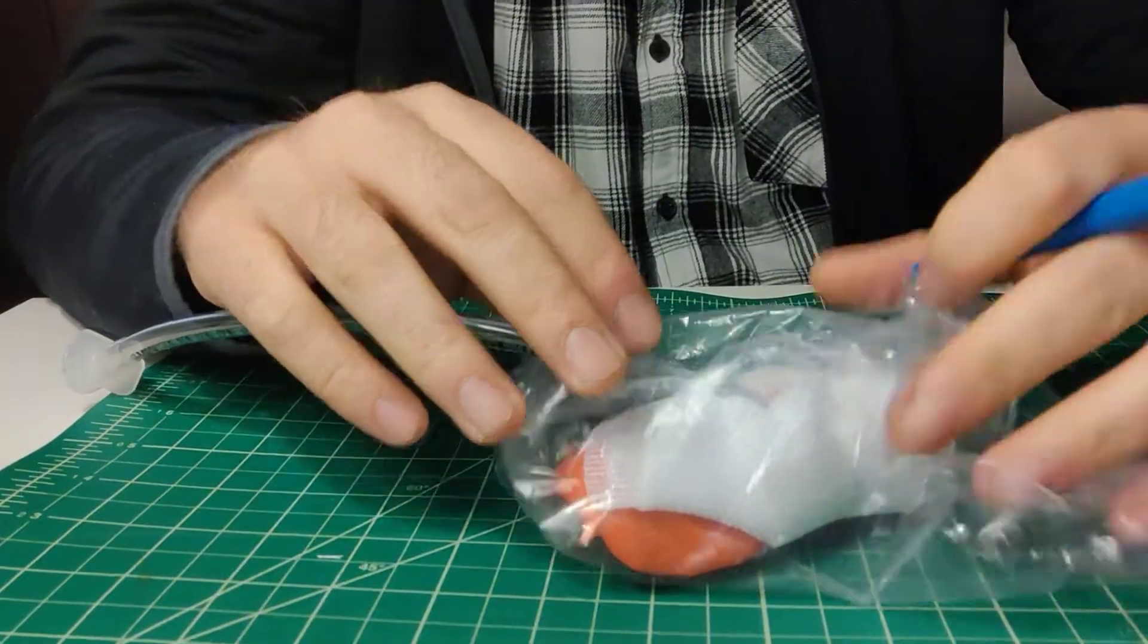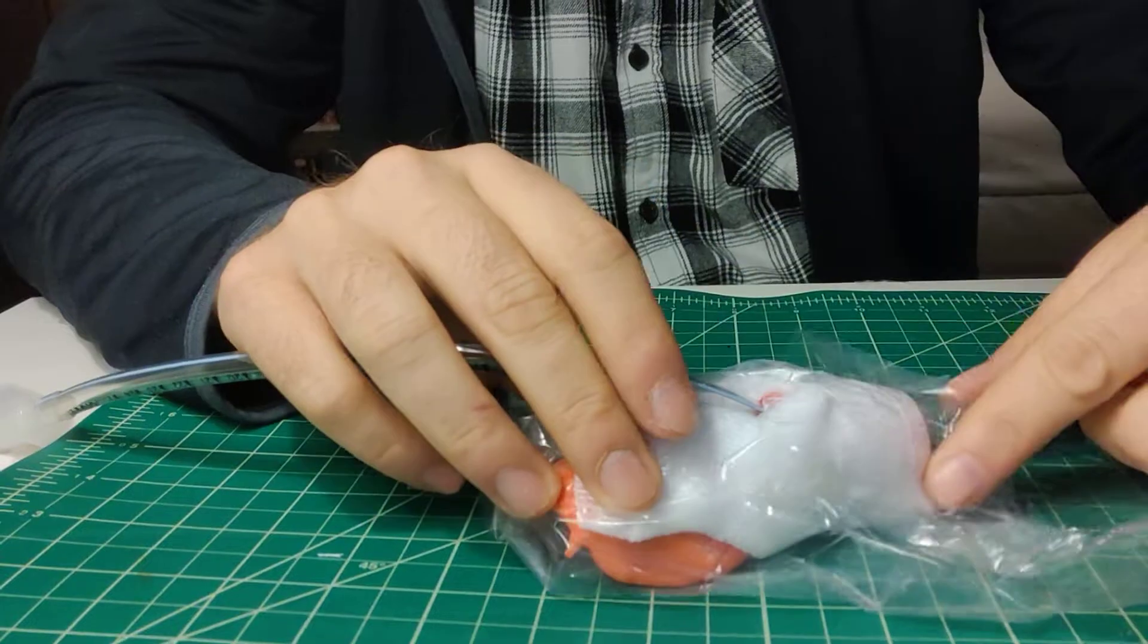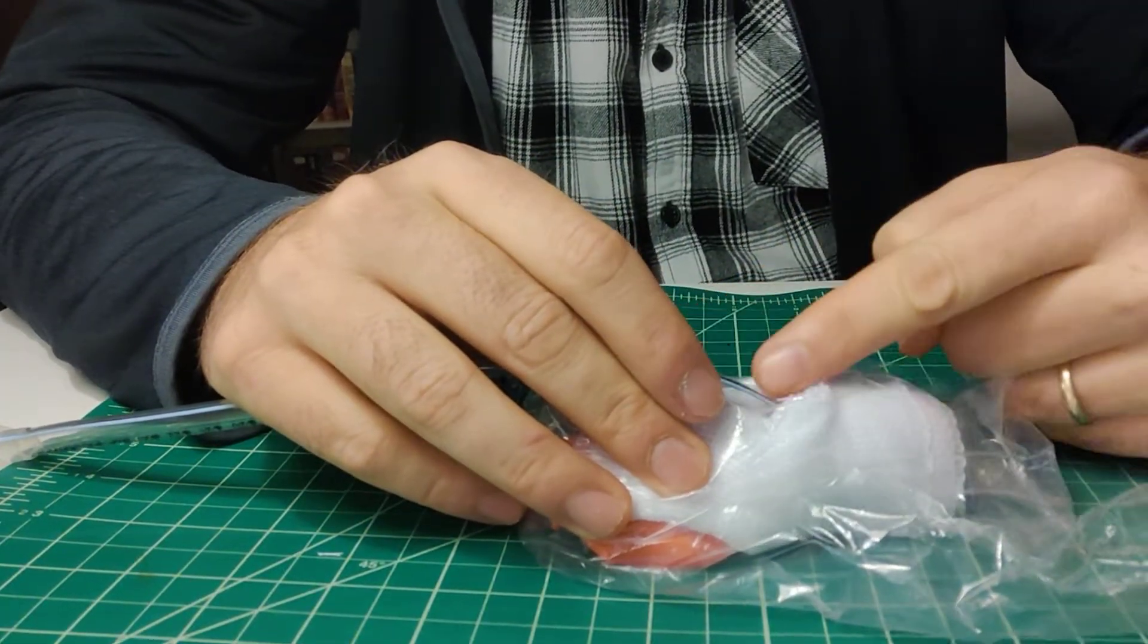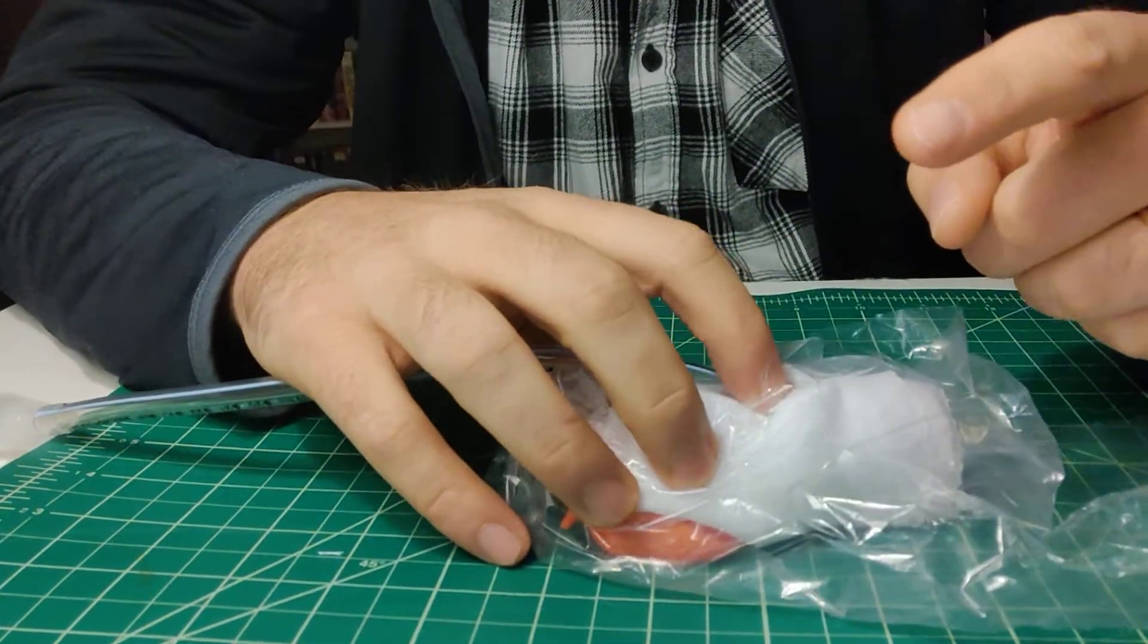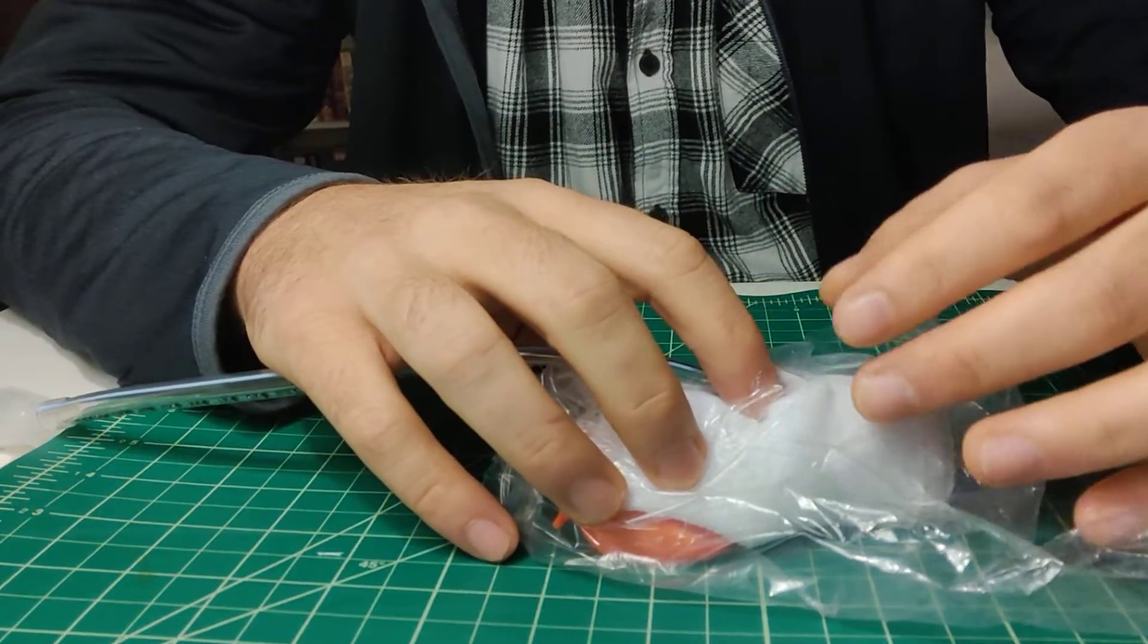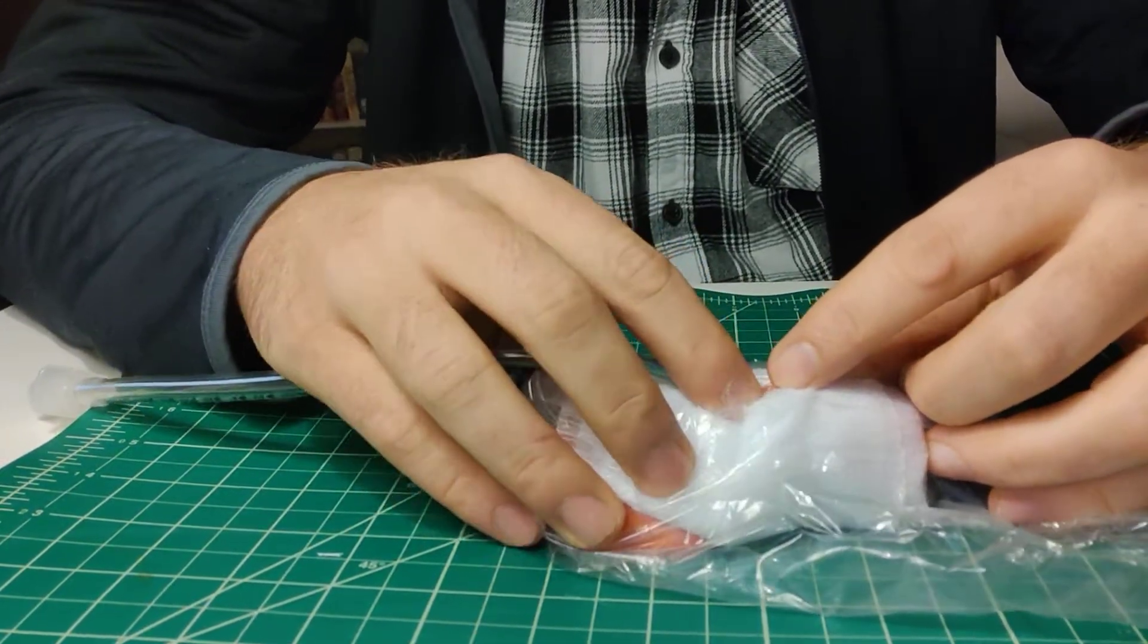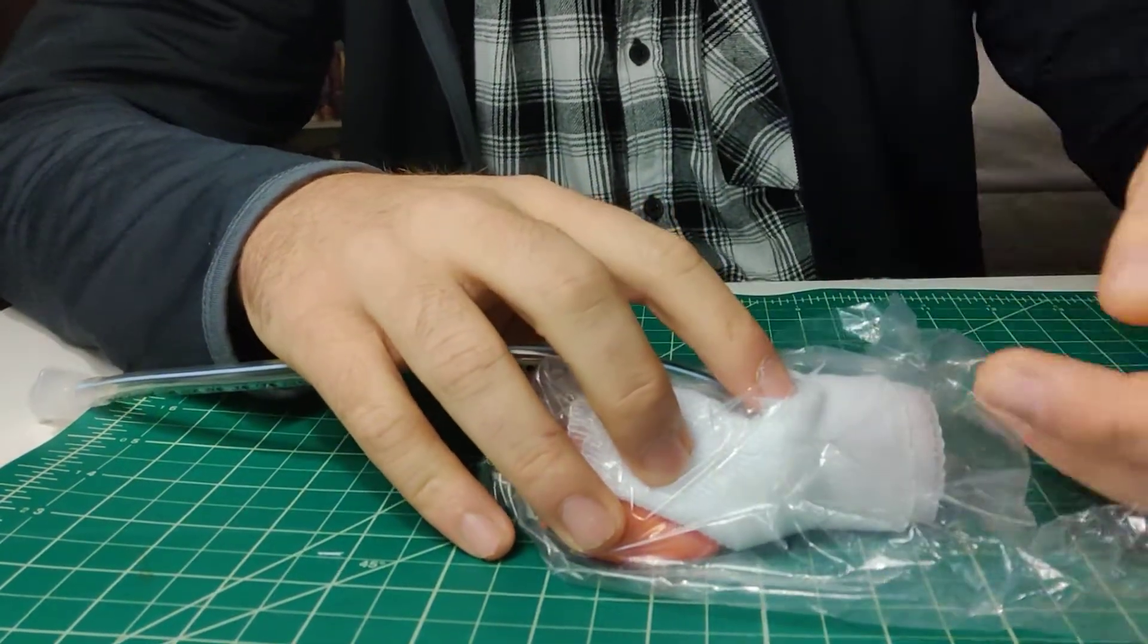Now let's move on to some tips and tricks and stuff like that. Number one, when you're making these incisions, practice not using your eyeballs after the first incision. What I mean by that is you can use your eyes to see where your first incision goes, but after that, train this finger to do it entirely by feel. This may be a super messy field. There may be a ton of blood. It's a tight space and you shouldn't be relying on your eyes to visualize the cricothyroid. It should be a total feel, not only to get to the cricothyroid, but you should teach your fingers how to bluntly dissect tissue. That brings me to my second point.